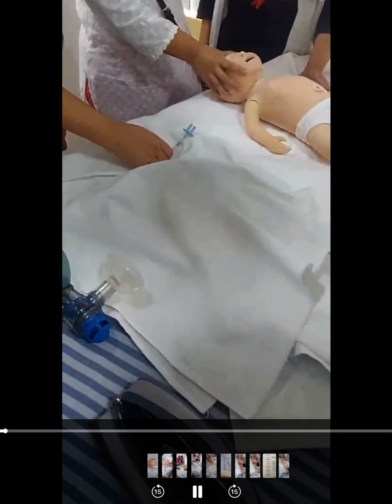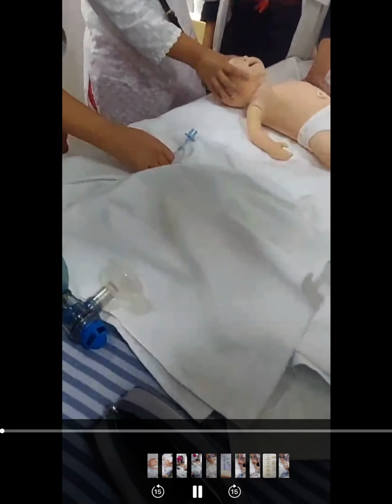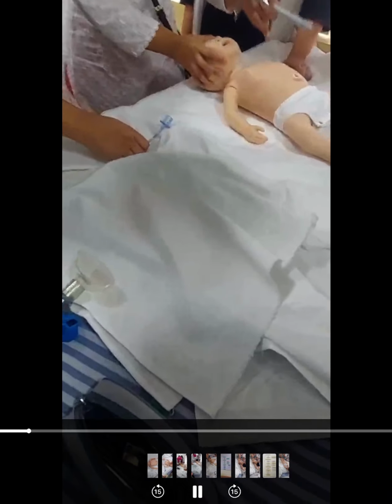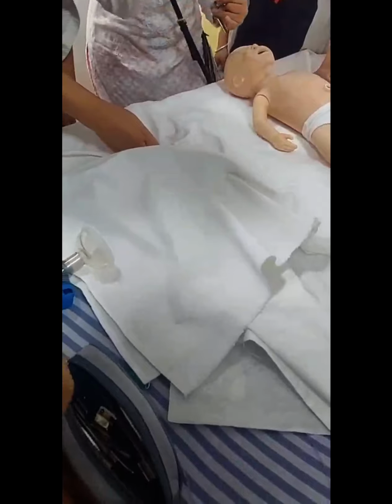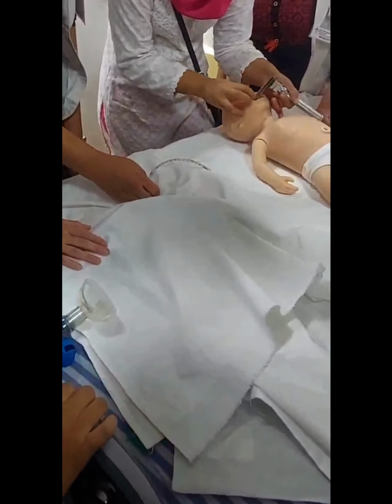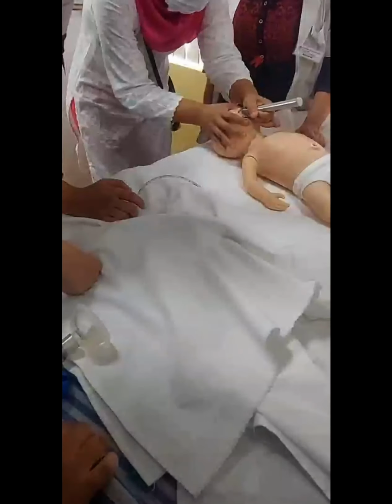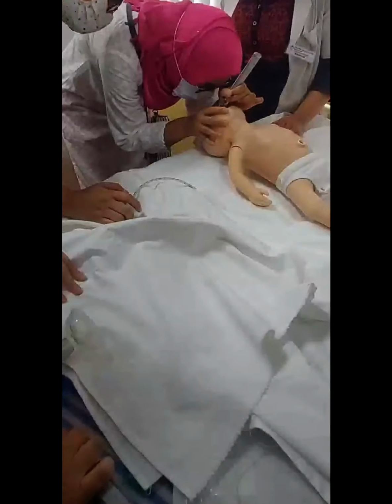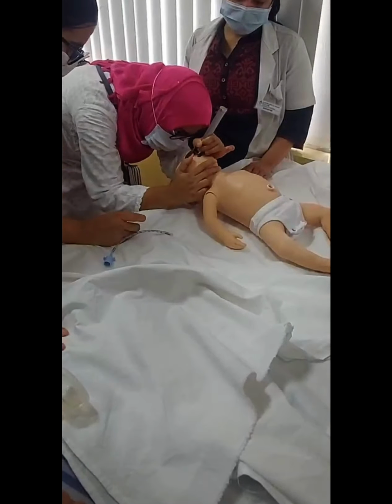Now see, guys, this is basically how you insert the endotracheal tube. Sorry, guys. We use the left hand. We hold the laryngoscope in the left hand, and we insert it through the right and take it towards the left. Enter from the right angle and go towards the left, deep enough, and try to visualize. Tongue. Okay, so we see it through this. The epiglottis should be visualized first.